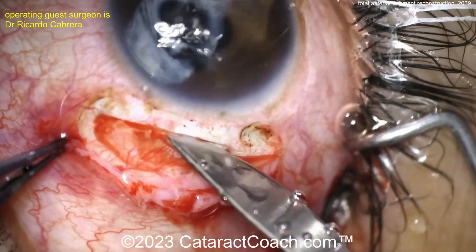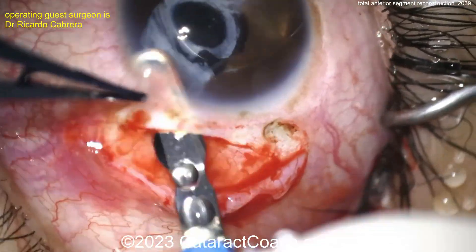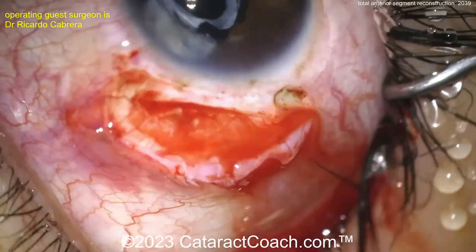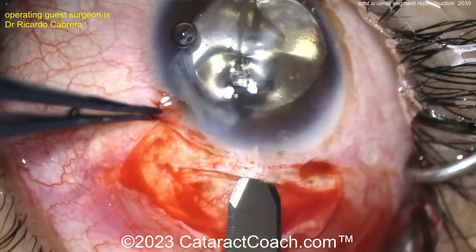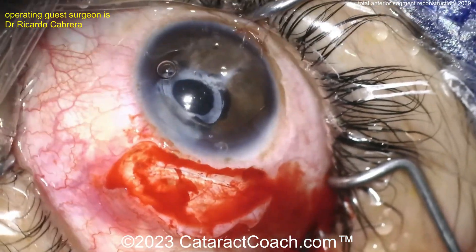There's the incision scleral tunnel. The patient already has a PMMA IOL which has been displaced, so that has to be explanted. The PMMA lens, as you know, cannot be cut in half — it's very hard, very rigid. You can't cut it, so you've got to extract it whole.